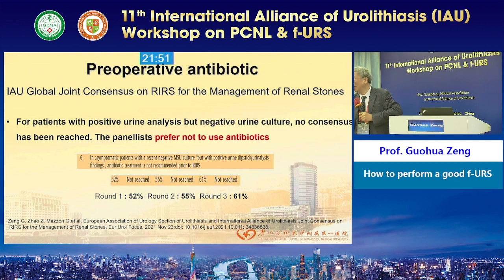How many people agree with Professor Campbell's opinion? Only 2. Antibiotic? Actually, in our department, for this situation, I always use 3 days of antibiotics, then do the operation.